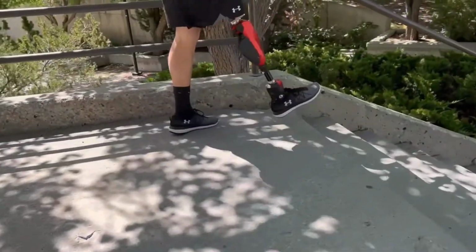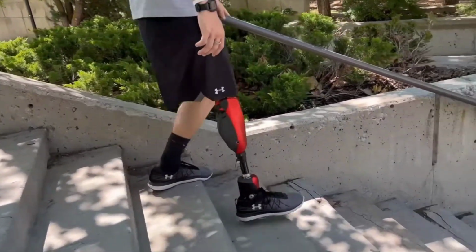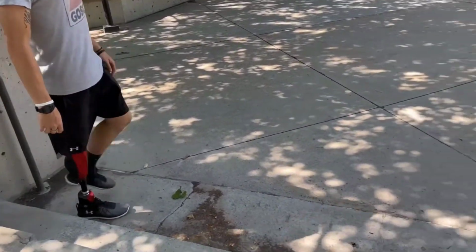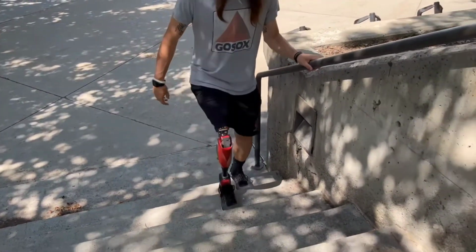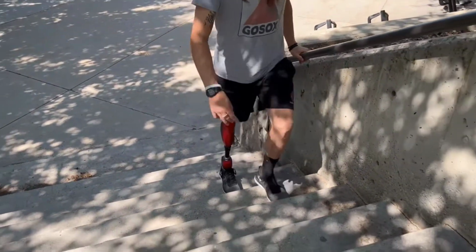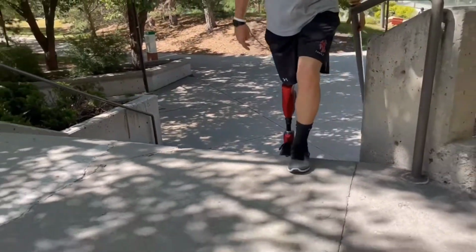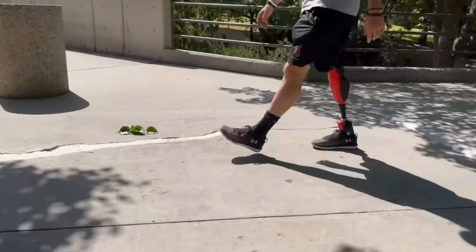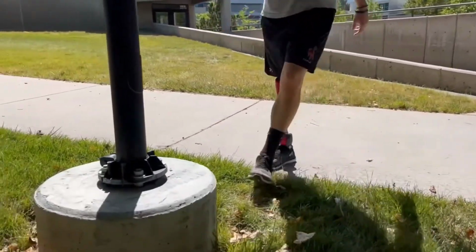Lenzi's Utah Bionic Leg gives amputees the additional ability to get up, sit down, and walk up and down stairs and ramps through the combined power of motors, processors, and cutting-edge artificial intelligence. Normally, amputees have to overuse their upper body and the intact leg to make up for the absence of support from their prescription prosthetics, but with this technology, it would be easier for them to do the tasks.